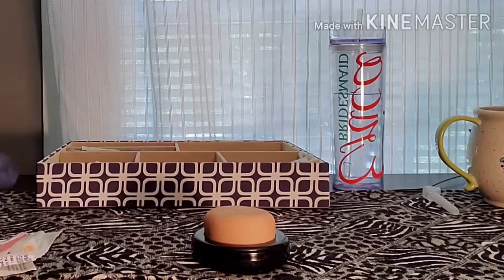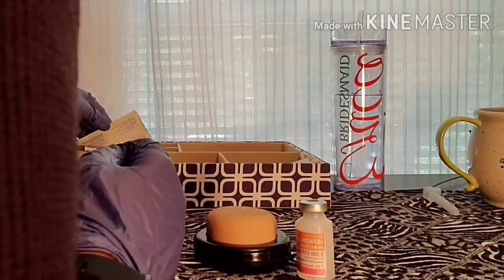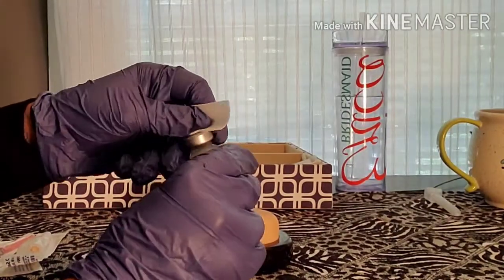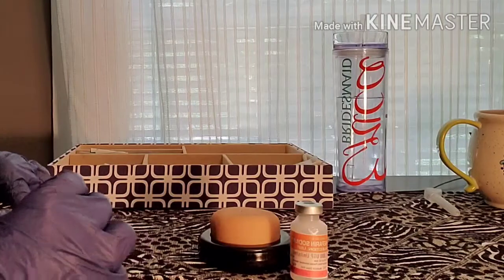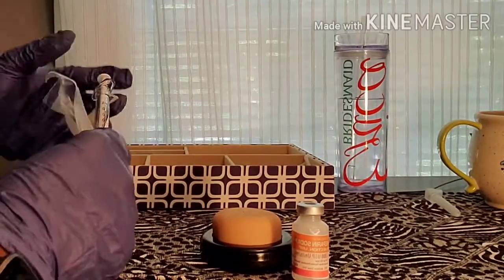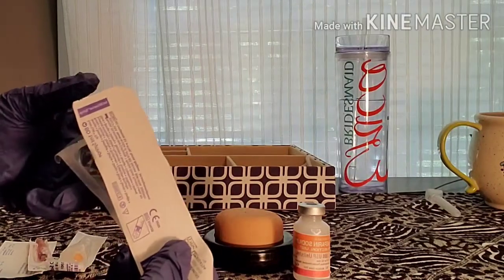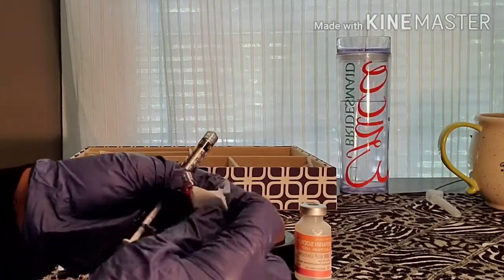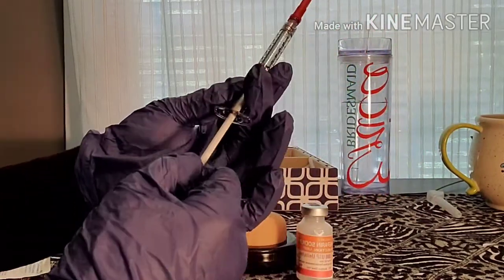I'm going to withdraw my medication — I'll show you again since I think it's helpful to see it a couple of times. I'm going to grab my alcohol and vigorously scrub the top for 15 seconds. I missed my syringe — you'll see nurses use a 3-milliliter syringe but I got in the habit early on of using a 1-milliliter syringe. I grab my syringe, expose my luer-lock flat needle, and pull back one milliliter of air.